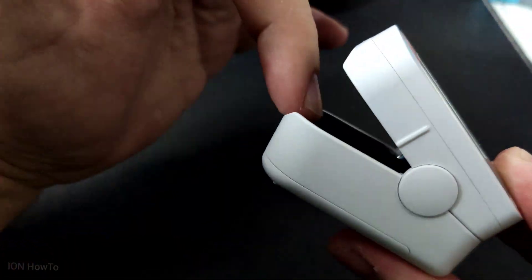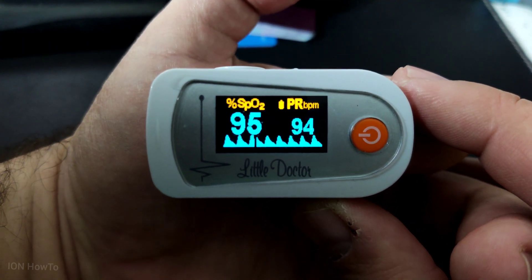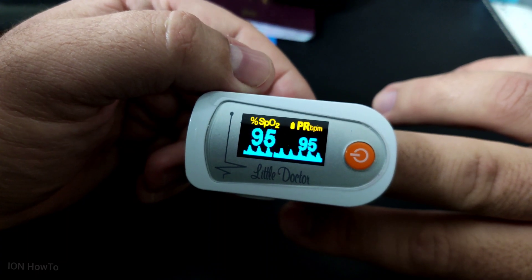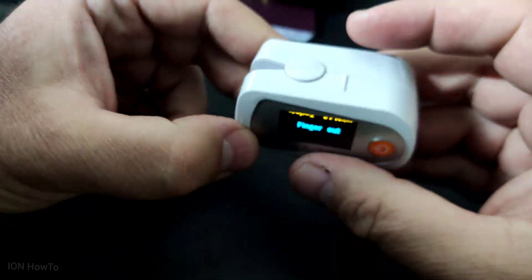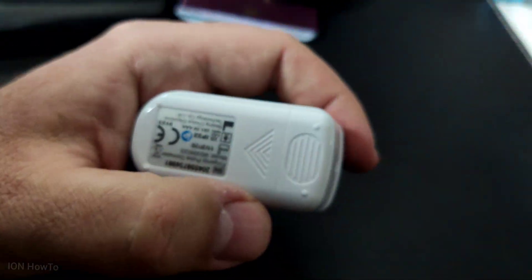It's also important not to wear fake nails or any nail polish. The nail should be clear when you use this — nothing on the nails or fingers to cover them, so that the reading is more accurate.